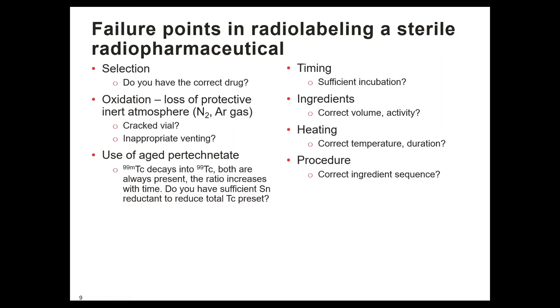You're going to see some bones. You cannot rely on the color of the cap. You need to read the label. And sometimes radiochemical purity testing can identify, whoops, you've got the wrong drug here.